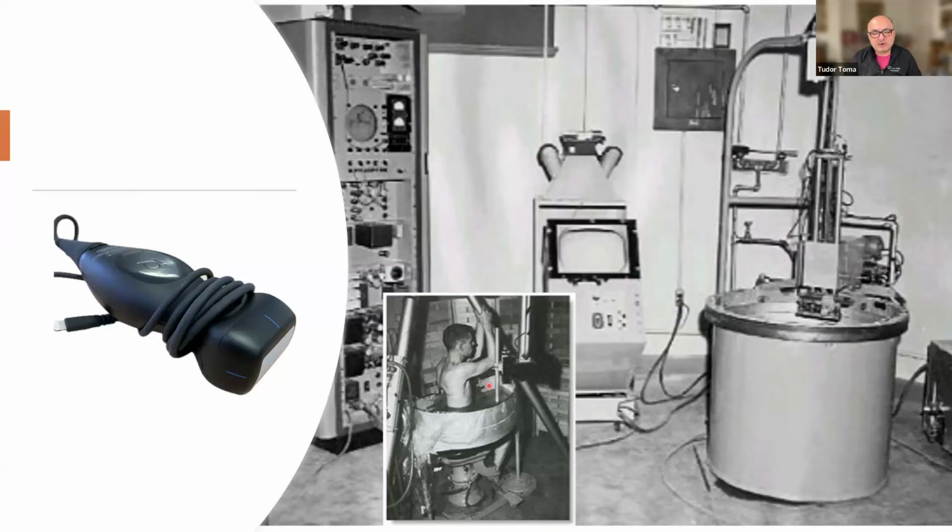So even that is a technological progress. And this is not only about the progress. The main advantage is the fact that with this equipment, you actually get the thoracic ultrasound where you need it and when you need it. This is particularly relevant for our talk in interventional pulmonology, because if you have it with you in your pocket, you can very quickly use it in a variety of circumstances in the IP room.